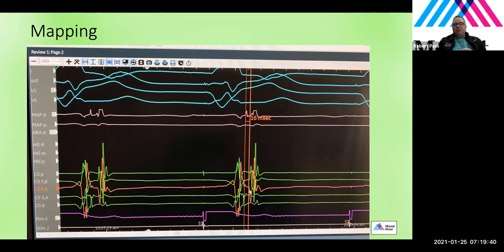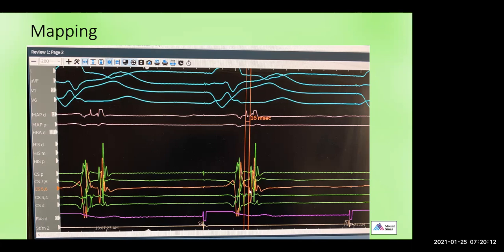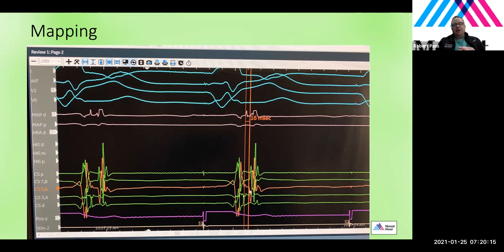But the real concern is that when the tachycardia terminates, in other words, if you are in the correct location and you successfully ablate the pathway, the heart rate will change quite suddenly from a very fast rate, in this case a rate of 135, to a sinus rate at, let's make a number up, 60. And so that often will cause the catheter to jump or move. The other advantage of doing it in tachycardia is that when you're in ORT, you're going down the AV node, and the only manner in which you're going retrograde from ventricle to atrium is via the accessory pathway.